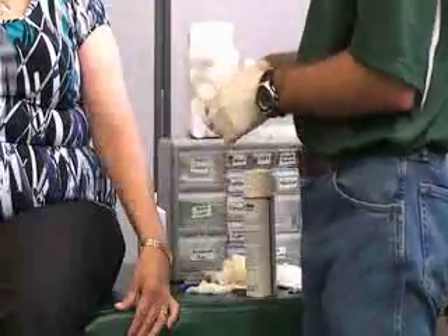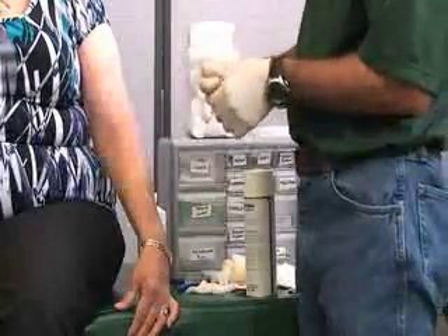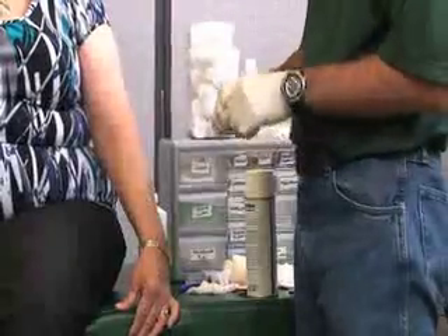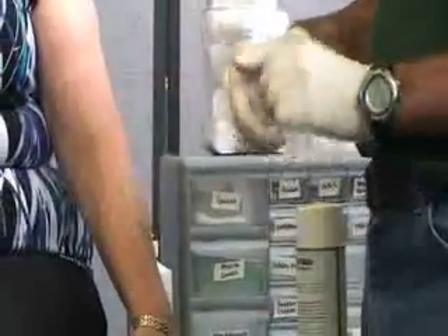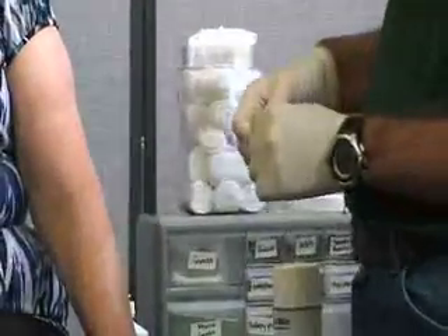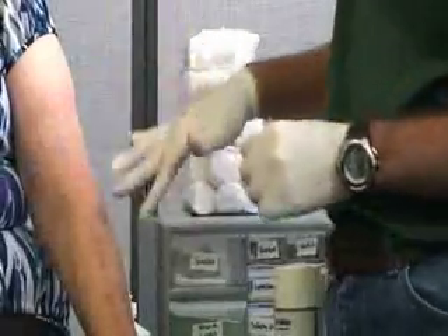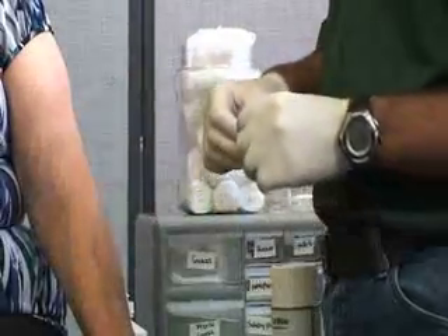Once we are ready for our butterfly bandage, one thing we always want to make sure is to check for signs of infection, or have them check for signs of infection later, for any open wound — especially for this one, because whatever caused the incision or laceration might cause infections.